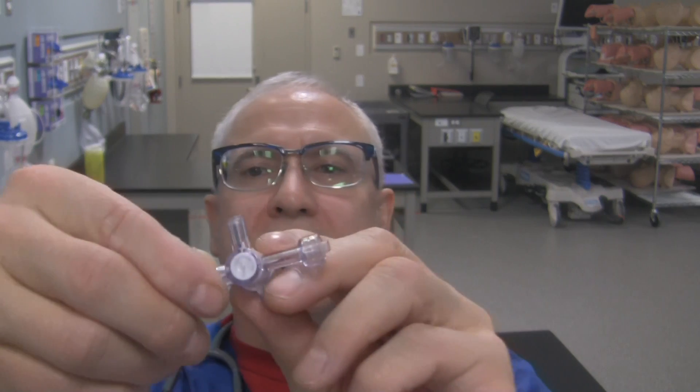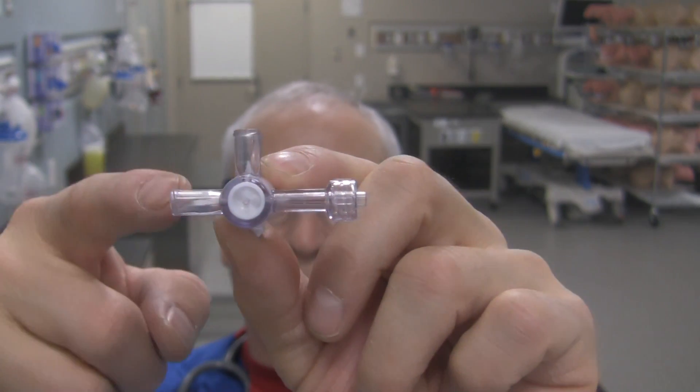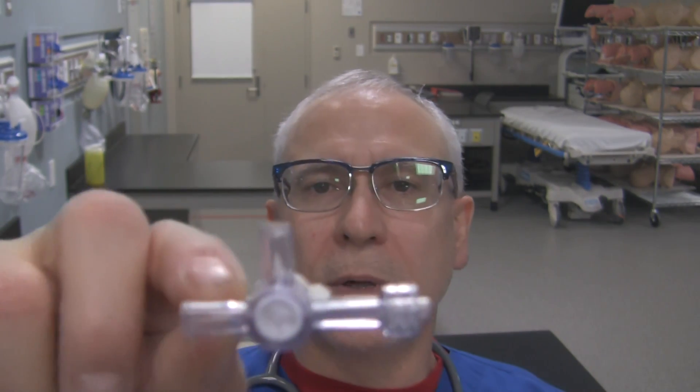Now this one here that I'm holding on to — it's got three ports and that's why they call it a three-way stopcock, because it has three ports. Female port here with luer lock, female port here with luer lock, male end port right over here with luer lock. So all these ports have the potential of communicating with each other.